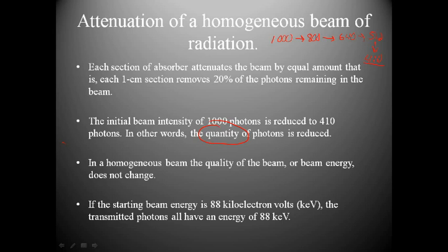That becomes very important: we lose quantity. But the important thing, which I'm putting a star beside, is that in a homogeneous beam, the quality does not change. The beam energy does not change. The 410 photons that still exist after 4 centimeters of tissue all have the same penetrating power.